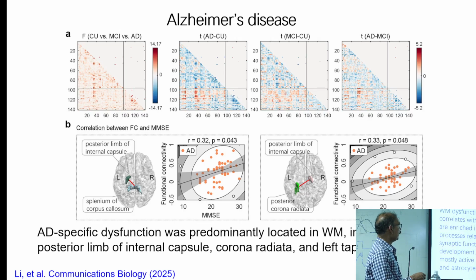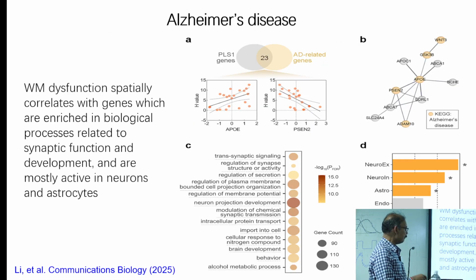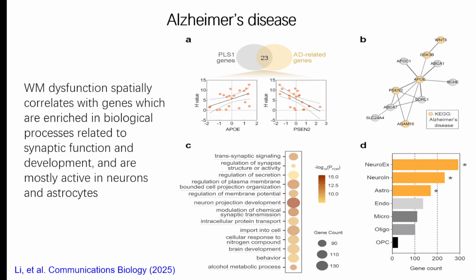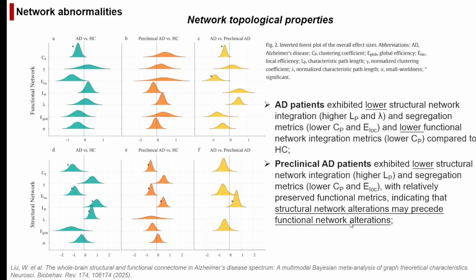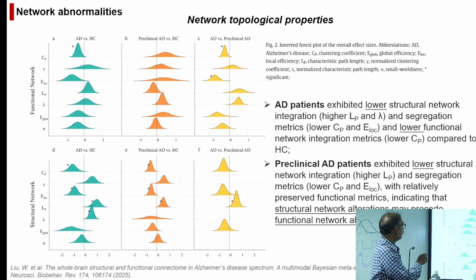And again, we are trying to look at the genes and then trying to look at these different measures of connectivity. Finally, again, using these kind of network properties like clustering coefficient, global efficiency, local efficiency, we can look at the differences in the distribution between AD versus healthy control, and see how is the distribution between the different ones.